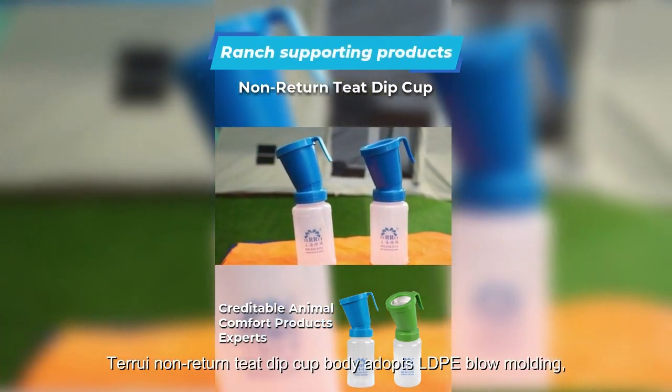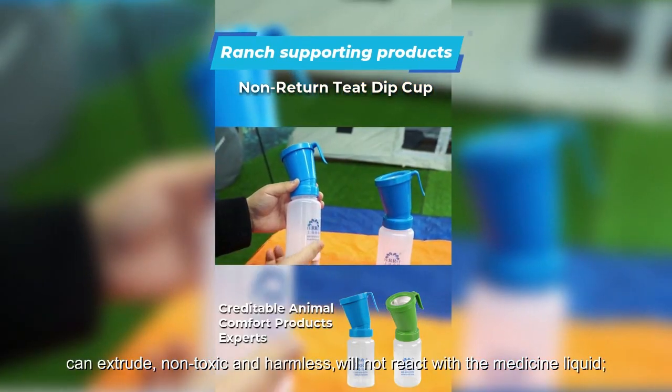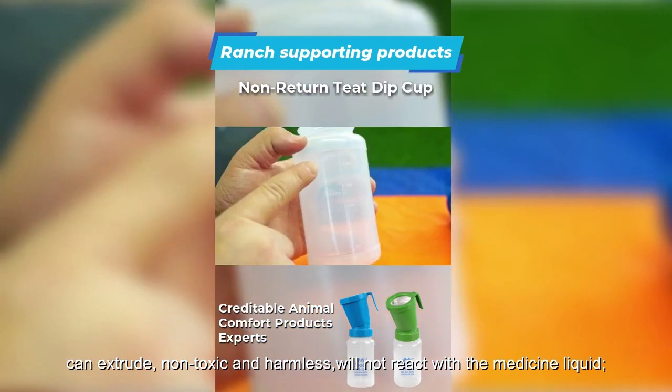The Terui non-return dip cup body adopts LDPE blow molding. It can extrude, is non-toxic and harmless, and will not react with the medicine liquid.